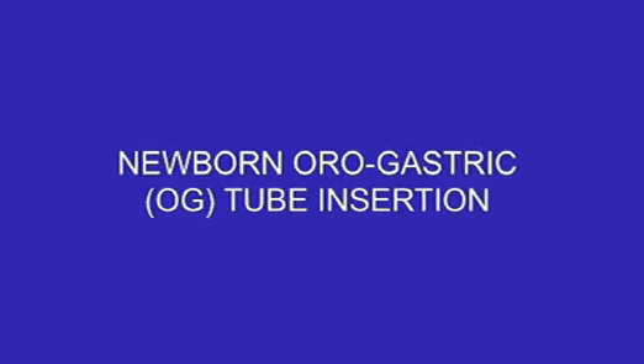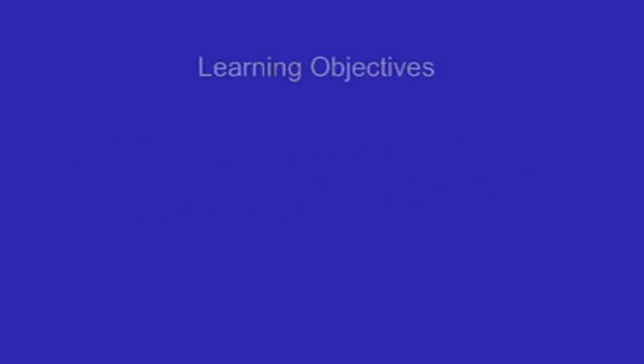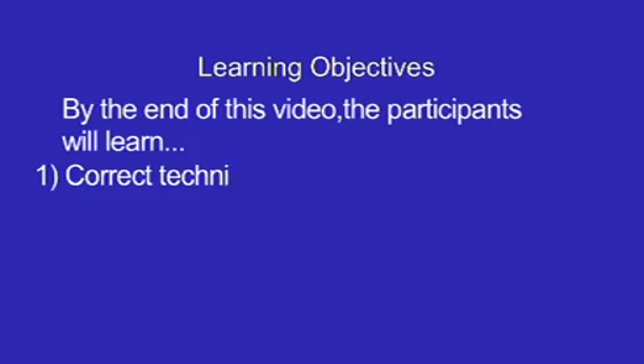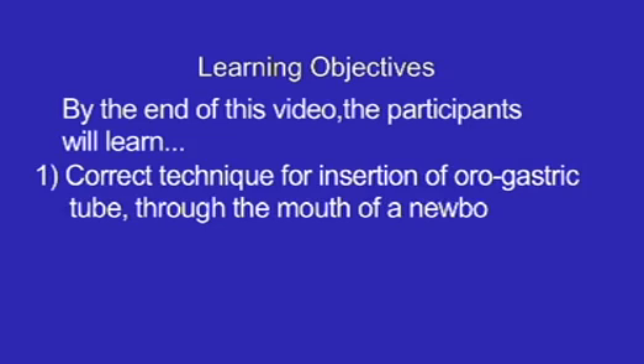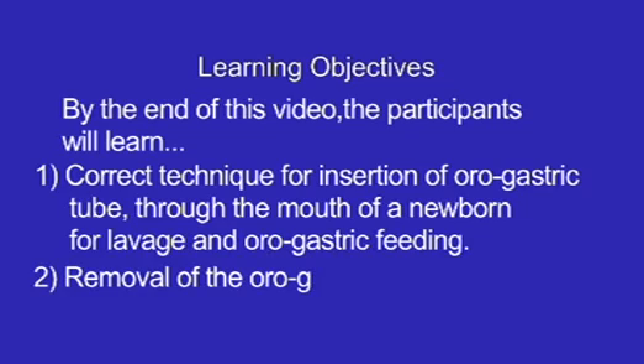New Born Orogastric OG Tube Insertion. Learning Objectives: By the end of this video, the participants will learn the correct technique for insertion of an orogastric tube through the mouth of a newborn for lavage and orogastric feeding, as well as removal of the orogastric tube.